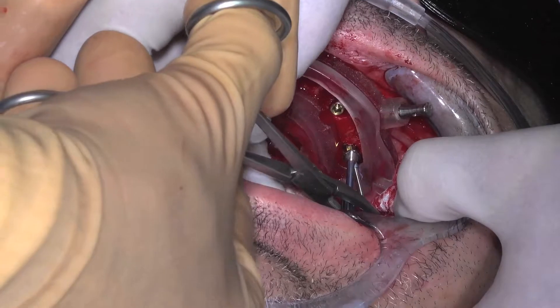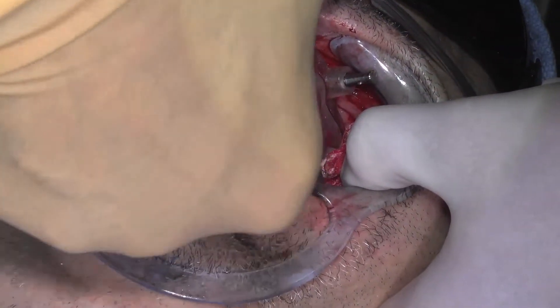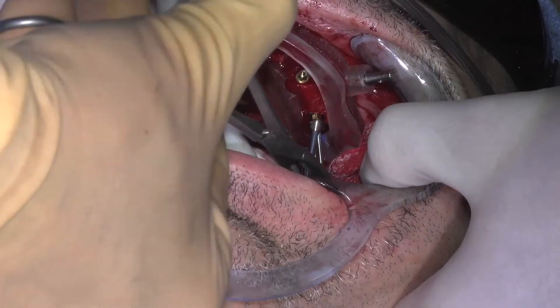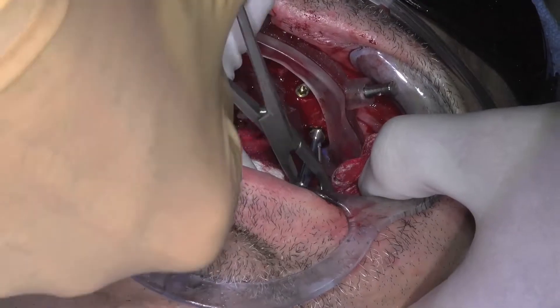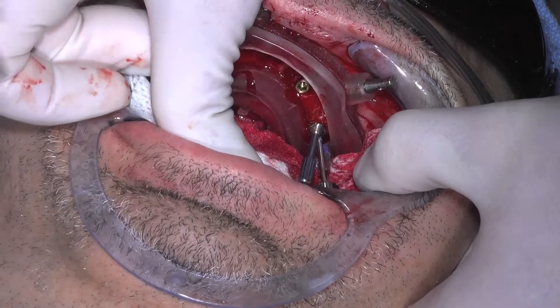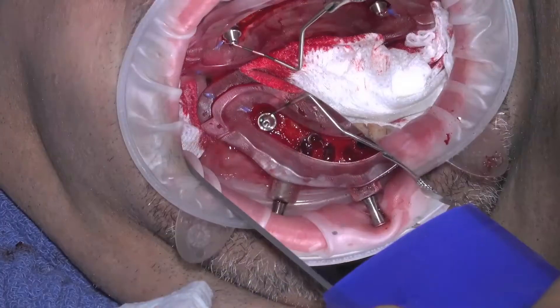Again, align the abutment screw towards the blue line on the angle rotation guide, tip and turn it into the implant until you feel the engagement of the hexes, then hold the multi-unit abutment in place and tighten the abutment screw. Repeat this for all of the angled multi-unit abutments.